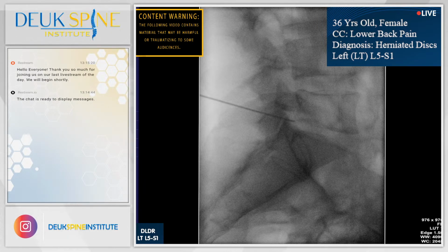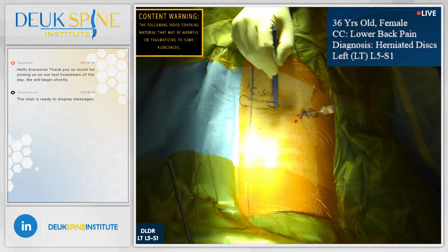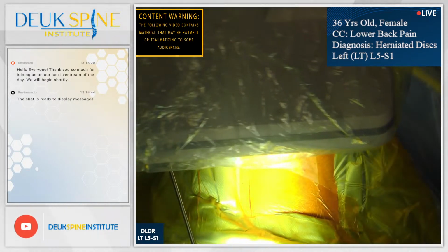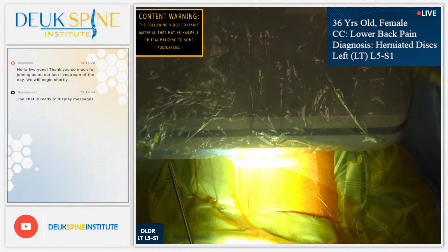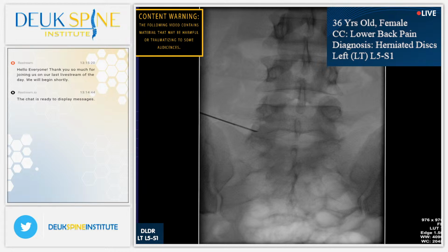All right. So this is L5. Let's get an AP, S1, and his herniation is here on the left side. We're actually coming around the spine. We're not going to remove any bone. We're not removing ligament. We're not removing muscle. We're not taking anything out. We're actually going through a natural opening on the side of the spine. You guys can see it from the AP view. The needle is coming in from the side through a hole that's already there. That is the beauty and brilliance of this procedure, is that it does not take away any bone or ligament or muscle. All right, shot.